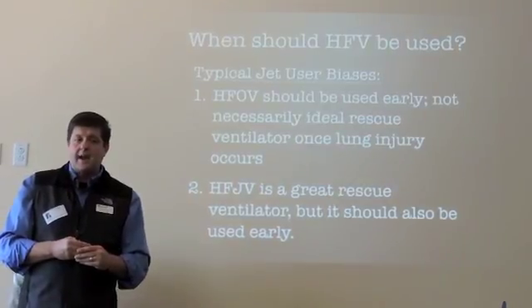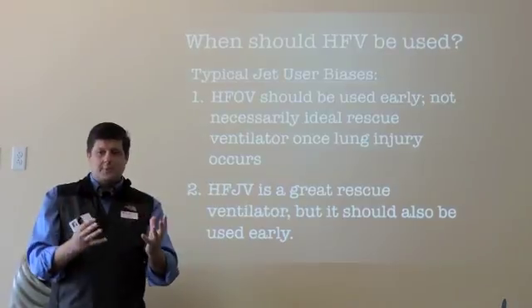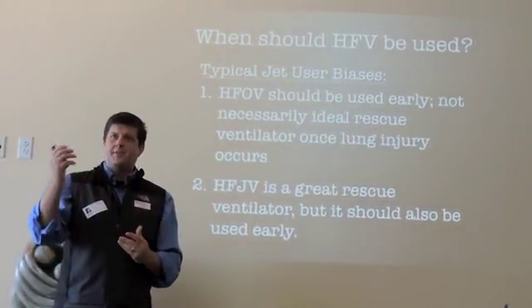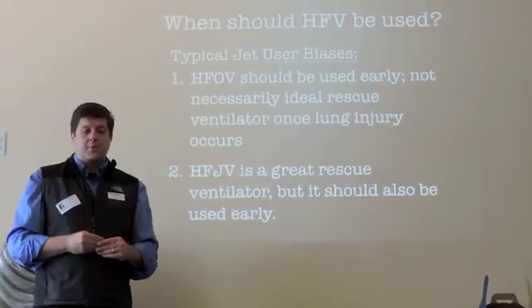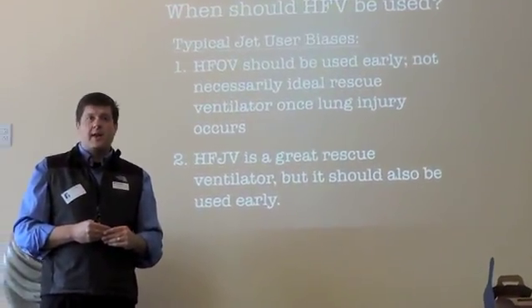So the best way to fix that is just do your normal assessment. Make sure the ET tube's in good position. Press the enter button, let the jet start over as far as trying to figure out what it needs to get to stabilize the PIP with the servo pressure, and then once you get the ready light on, then you're good to go.